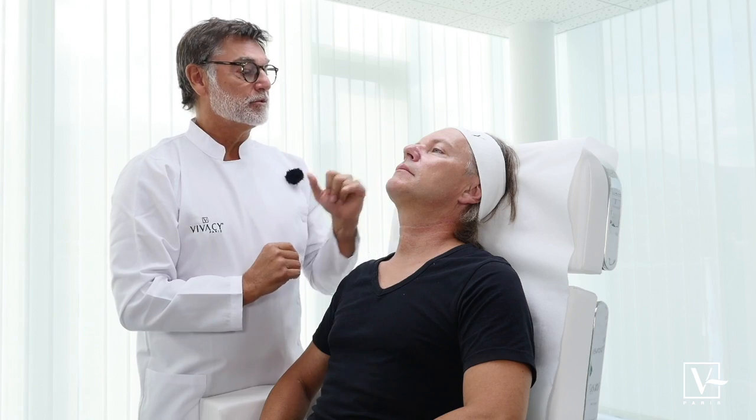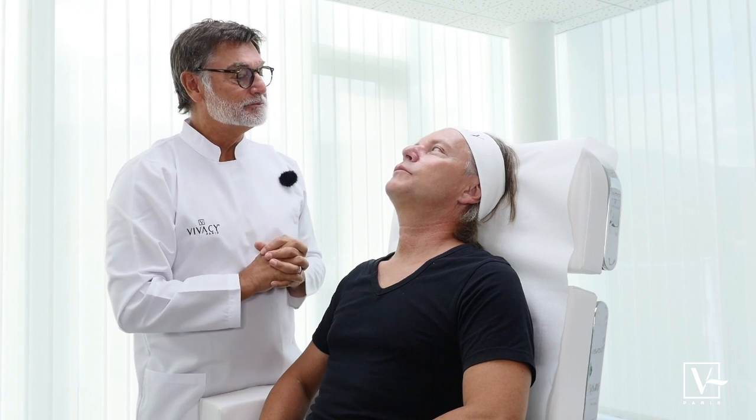At the end, it would be a good idea to shave a little bit the nasolabial angle with Stylage M. And then we're going to see if this is perfect. Sometimes I also like to use a bit of Stylage L on the lateral part of the eyebrows. Okay, ready? Ready.